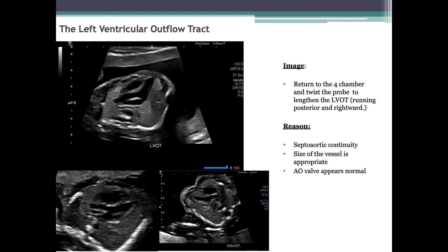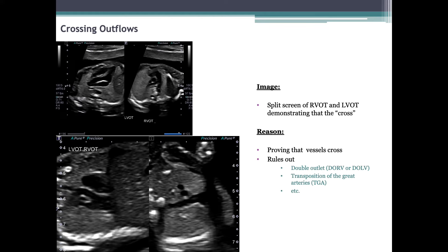The left ventricular outflow tract is acquired by returning to the four-chamber view and twisting the probe to lengthen the LVOT, running posterior and rightward. This view demonstrates that the perimembranous ventricular septum is intact and continuous with the left ventricular outflow tract — known as septo-aortic continuity. It is useful in determining that vessel size is appropriate and the aortic valve appears normal. For crossing outflows, while the fetus remains in the same position, split the screen and document the left and right outflow tracts showing that the vessels cross. Proving that the vessels cross rules out double outlet right ventricle, double outlet left ventricle, and transposition of the great arteries (TGA).